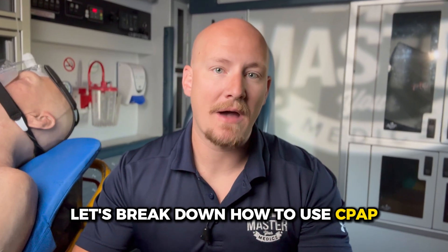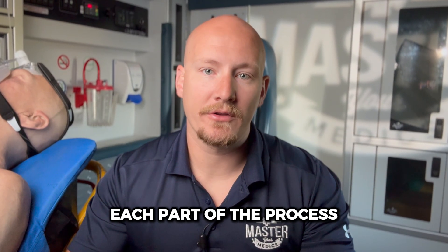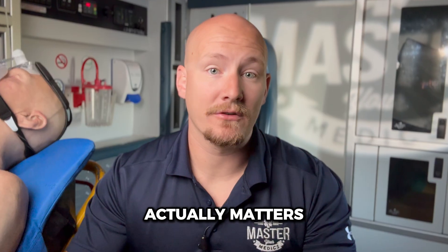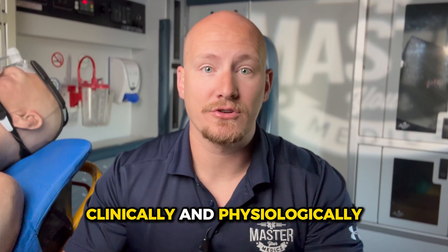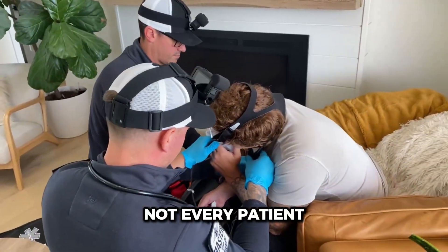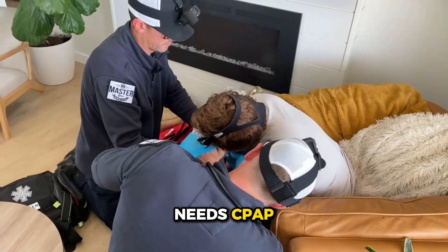Let's break down how to use CPAP step by step and talk about why each part of the process actually matters, clinically and physiologically. Not every patient that's in respiratory distress needs CPAP.